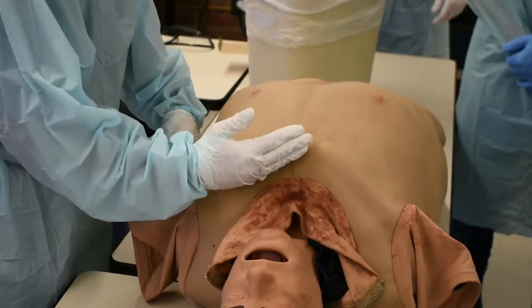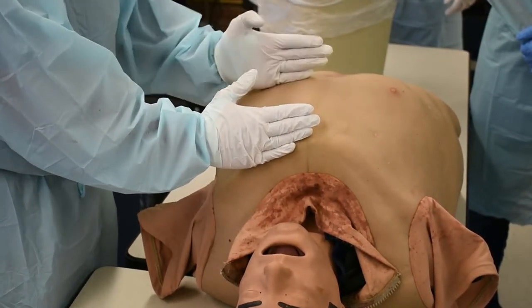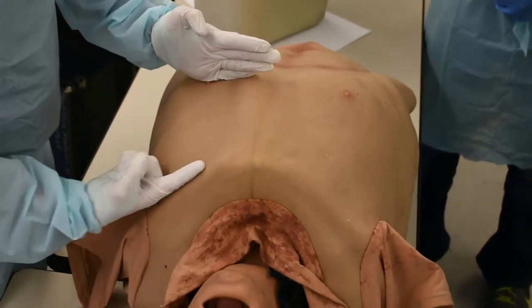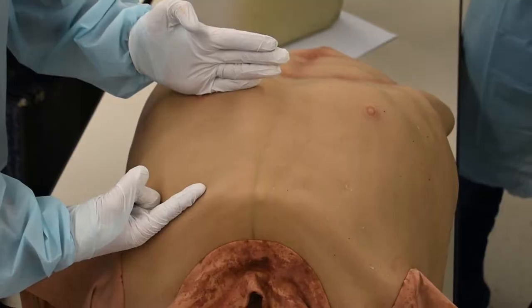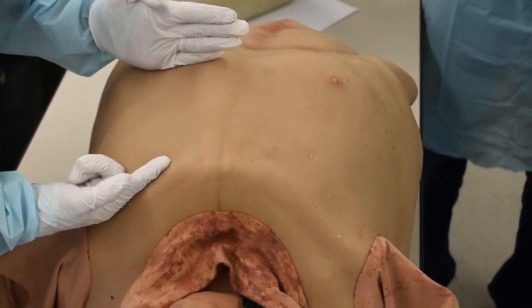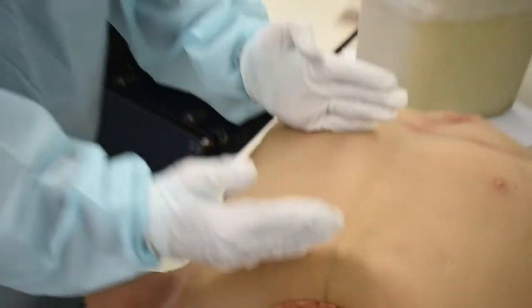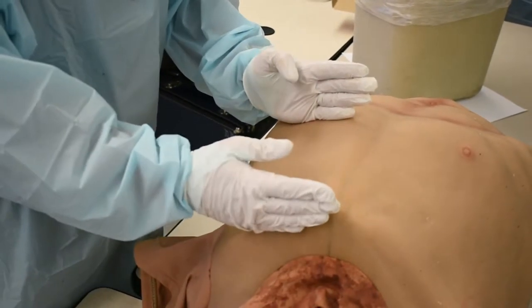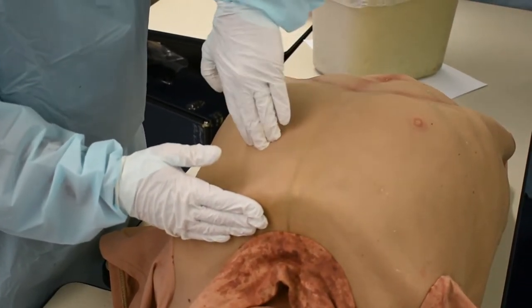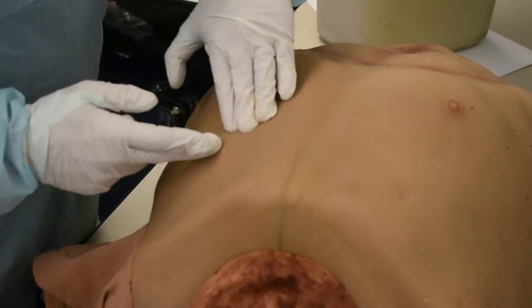So you're going to expose the area. I find the patient's clavicle and I find their anatomic nipple line — that is rib four, that's T4. The clavicle and your first rib runs just under your clavicle. So we're going into second or third intercostal space, mid-clavicular line. I have rib one and rib four. I automatically cut that distance in half and start palpating. On this patient I can feel their rib right along my finger border here.